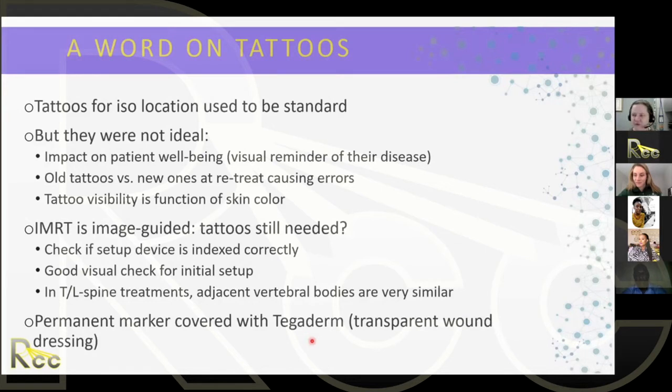If you, like me, had a kid who paints themselves with a Sharpie, you know how hard this actually is to get off your skin. And they come in a lot of different colors. I have used silver ones for darker skin colors. They show up really well, and you can play around with skin tone versus Sharpie marker to see what shows up well.